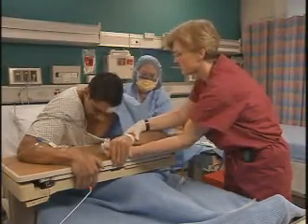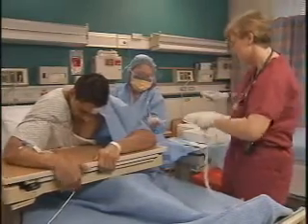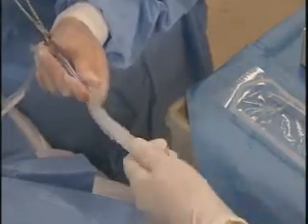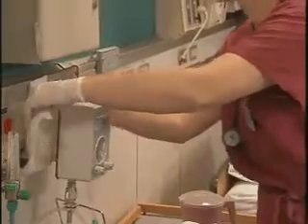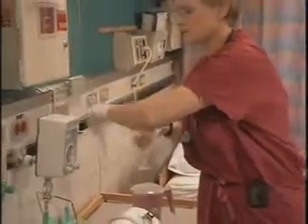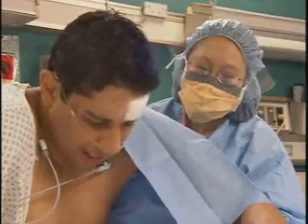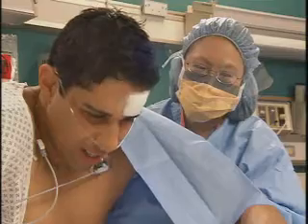After the chest tube is in place, help the physician connect it to the drainage tube on the closed chest drainage system, keeping the connector sterile. As ordered, set up wet suction, dry suction, or gravity drainage. The type used depends on how much air must be removed and how quickly the pneumothorax must be resolved. Try to relax and let the chest tube do its work.